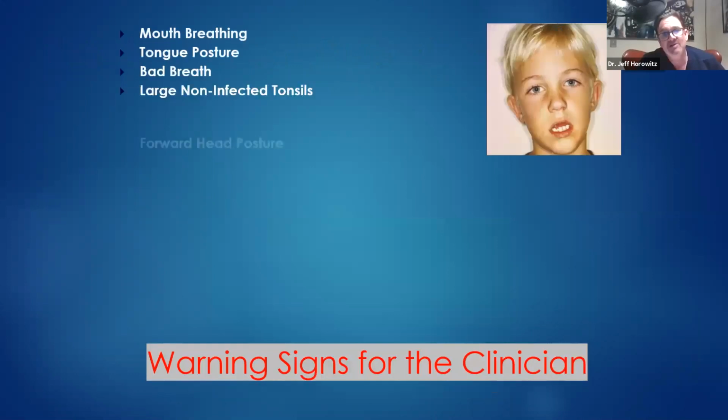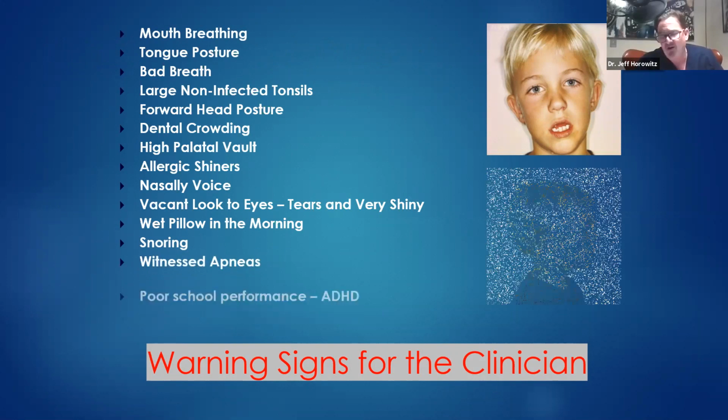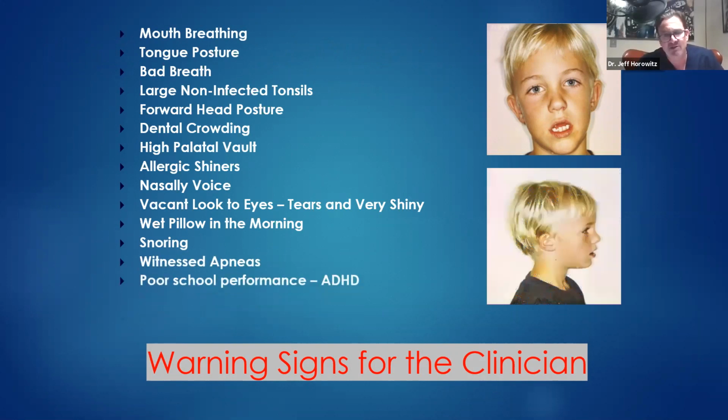So there's a lot of things that kids will come in with, you know, cross bites and mouth breathing and teary eyes, allergies, high palatal vault. These are all telltale warning signs, and I want you to pay attention. You know, one of the things that I always hear is, Jeff, are you crazy? Are you taking cone beams on children when they come in as new patients? And I say, you bet you I do.